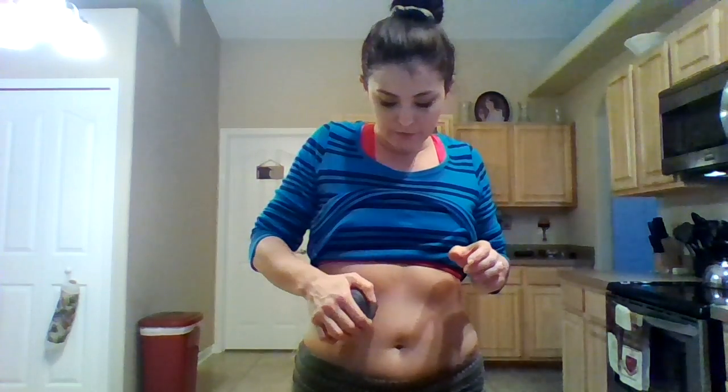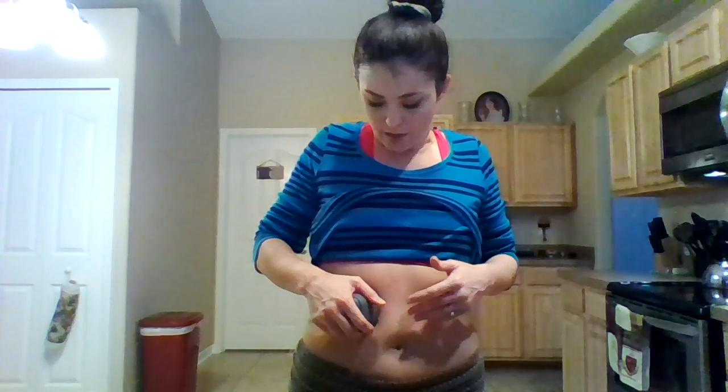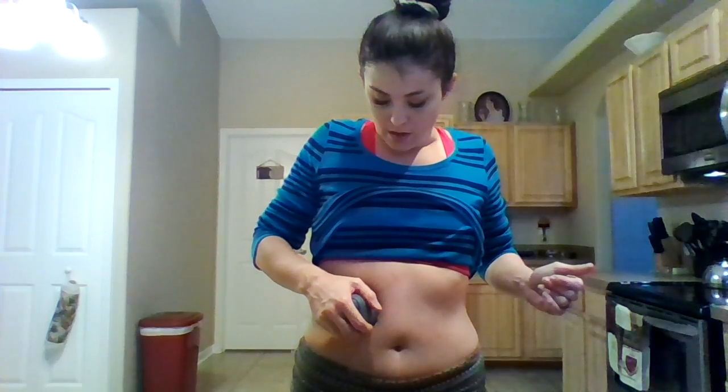So you hold the green Tic Tac button facing down because I want my transmitter to go on top of this. This is the way my trainer taught me, and this has just worked for me for the most part. So, you find the spot you want it to go in, pretty much straight up and down if you can get it that way. I'm kind of OCD, so I try really, really hard to get it that way. And then you push and let go the first time.